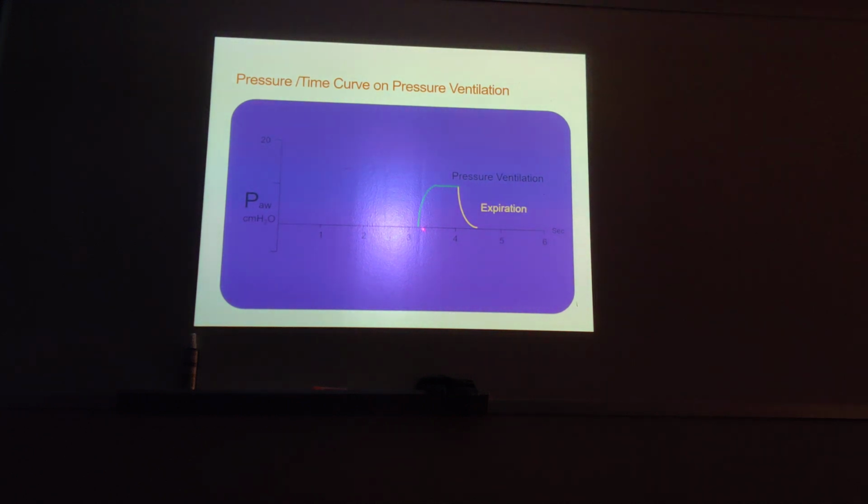Now you can see how it's curving like that. That's your rise time that is causing it to be that way. If my rise time was set at 0, it would be just like a straight line up. It will shoot up straight like that. But rise time is pressure slope. We're sloping the pressure, how fast it's going to get to the patient or how slowly.